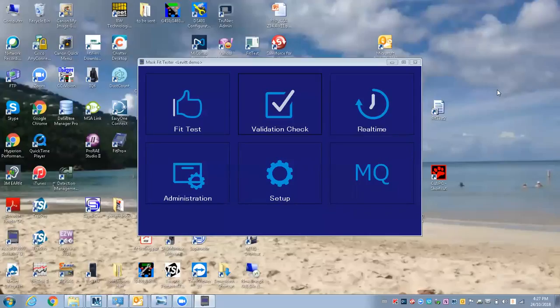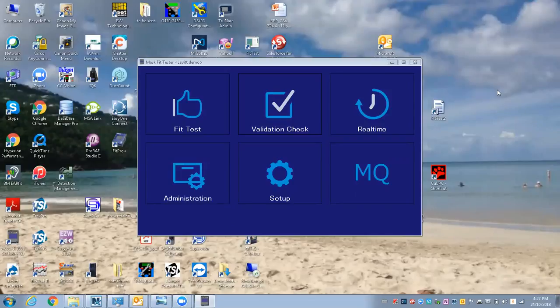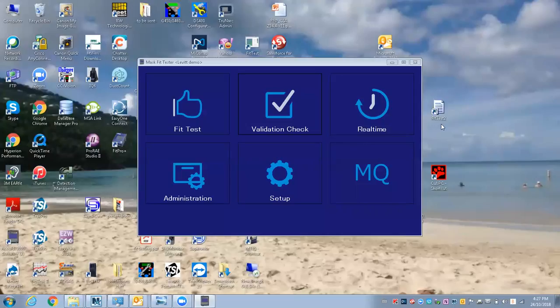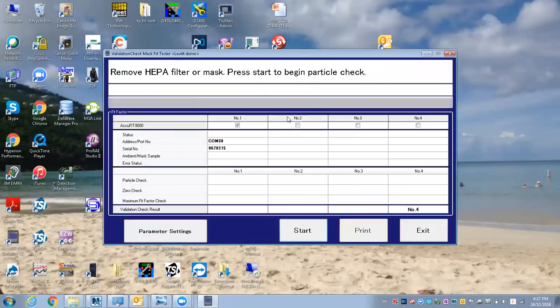I've started up the AccuFit 9000 and connected it to the computer with the USB cable. If I wanted to do some fit testing, the first thing I'd want to do is go into a validation check, which is basically your daily check.